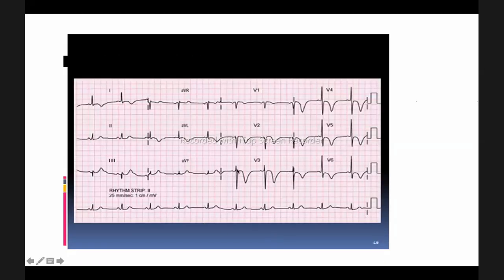So this is an example of a patient who had an MI, okay? It was taken at a different time after the ST elevation had started to come down. But what is so prominent here is these very deep symmetrical inverted T waves, which were not present in that normal ECG, all the way from the anterolateral wall. So they must be in the proximal LAD, or left anterior descending. Maybe that is where the occlusion is in this myocardial infarction. The troponins and CKMB would be positive in such a patient.